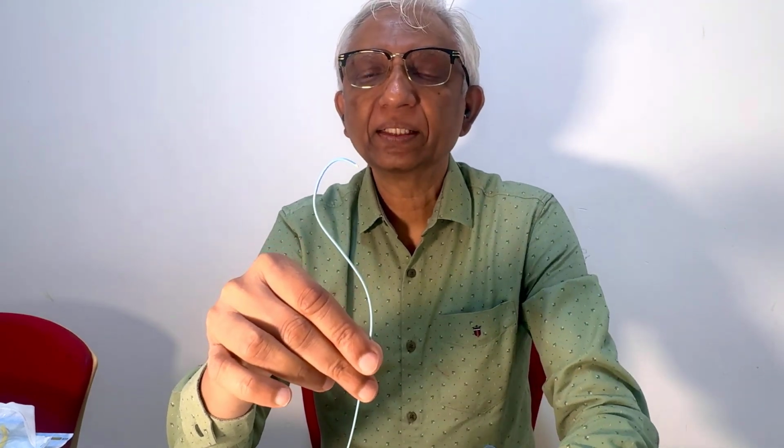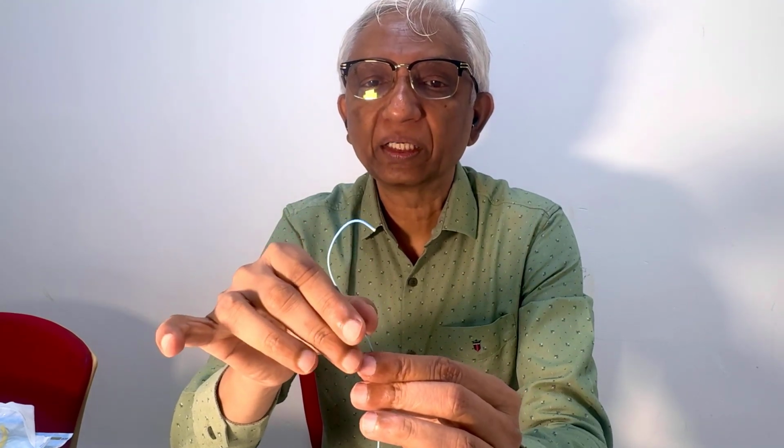Okay, I want you to understand this concept. So what does it do? Technically, if you have the aorta here, it pushes, right? So if the aorta is dilated, you will use a bigger curve. Have you got this idea? You're going to use a bigger and bigger curve. So you will use a Cobra 2 or a Cobra 3 if it's a very dilated aorta. If it's a normal narrow aorta, you can use a Cobra.